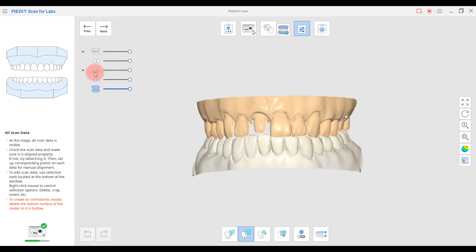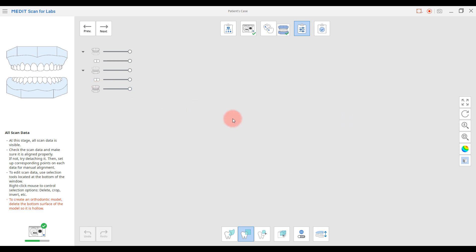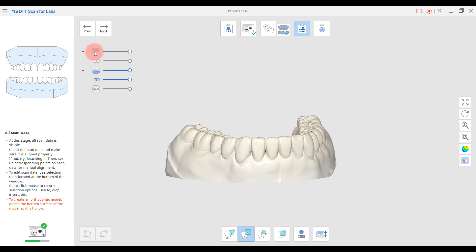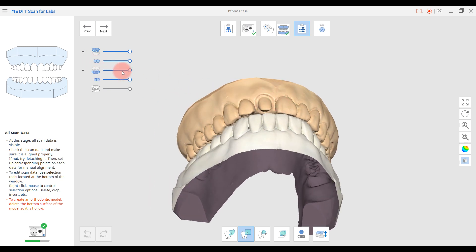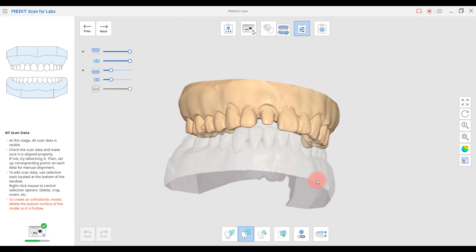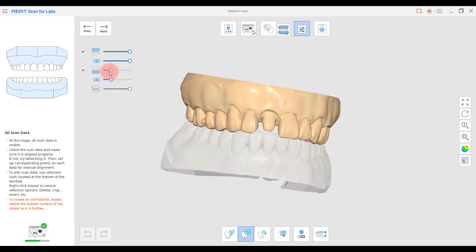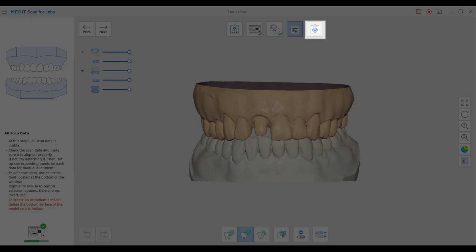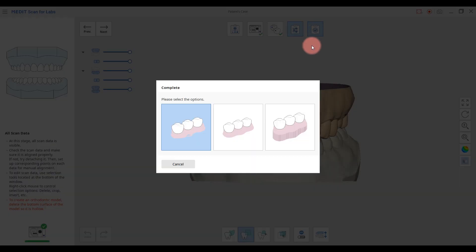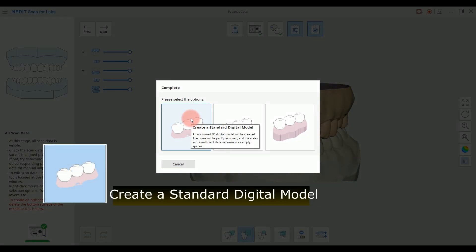Once the scans are aligned, you can utilize the tree view to confirm the data. Then, please click the Complete button. If you click the Complete button, additional editing functions will appear as follows.